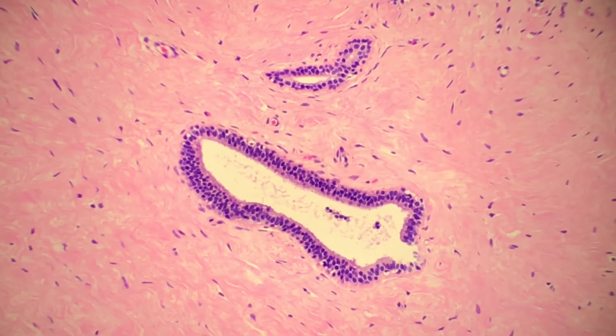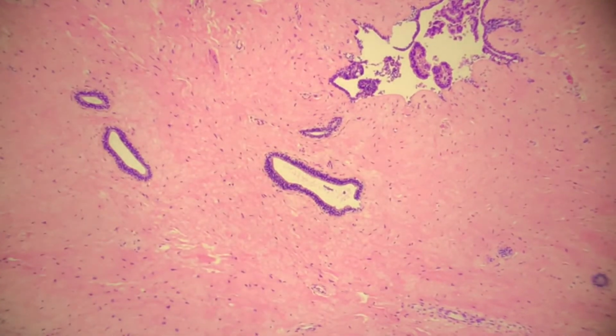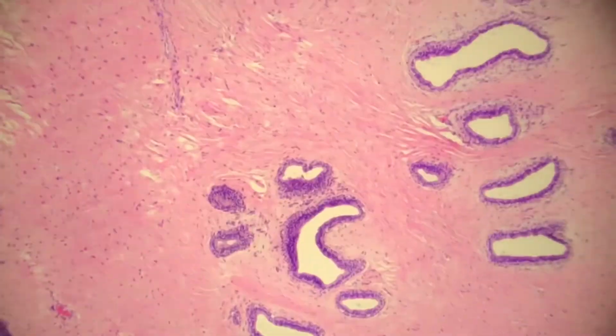Extremely rare to find in stroma of these would be bizarre giant cells. And bizarre giant cells just means like the nuclei within it are very irregular. They're not round. It doesn't just look like there's a whole pile of nuclei within a cell. They just have this very funny look, and often very eccentrically placed irregular nuclei. Something else that you can rarely see in fibroadenomas is heterologous elements. And heterologous elements are normal tissues that are present in an abnormal place. So what does that mean? In a fibroadenoma, that might mean that maybe you have some cartilage formation, some bone formation. You can occasionally see things like muscle, but we do have muscle in the breast normally, right?